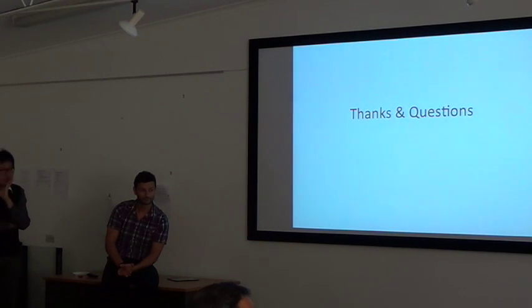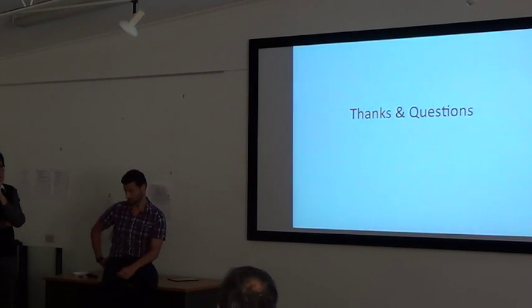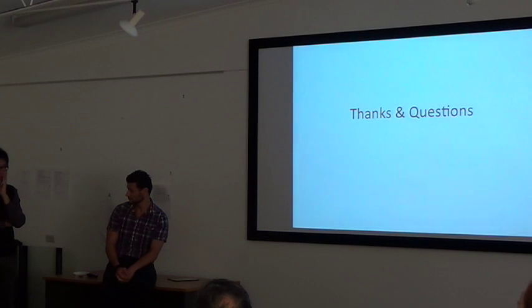We use single-voxel signals for MRS. Do you have much trouble with shimming? Do you find you have to do manual shimming as opposed to automatic shimming? I was looking at the MEGA-PRESS sequence and wondering if we would have the same issues with that. I haven't done MEGA-PRESS on ours, but for the traditional sequence, I think automatic routines will do the work.